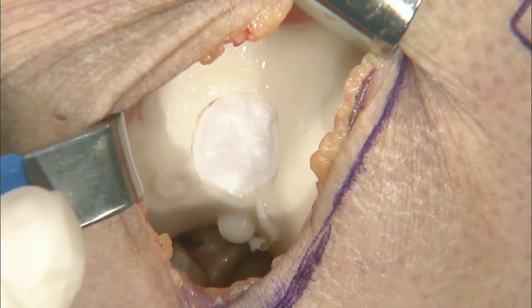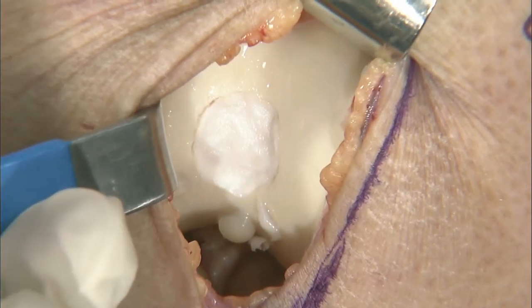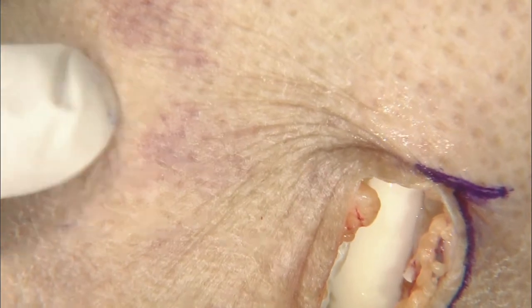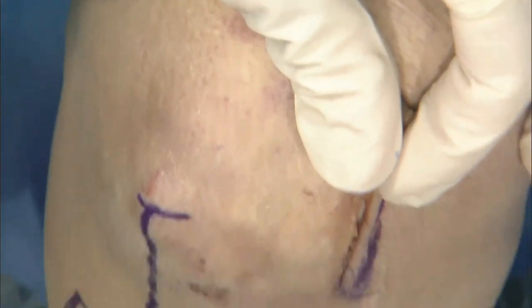So basically, kind of give it 3 minutes to harden. And then I think one of the really important things with MACI, again, that's differentiating it a bit, is I think we're probably hard enough to move forward. So once we have our 3 minutes, you basically can take everything out, kind of close, I'll use a towel clip here, something like that. And then basically you want to, once you pan out a bit.